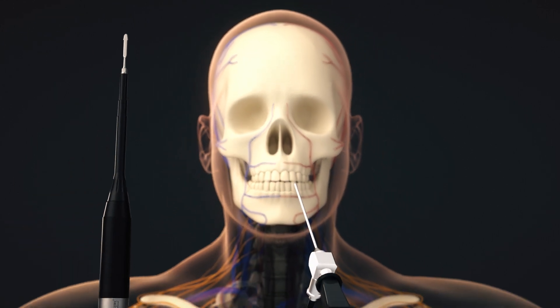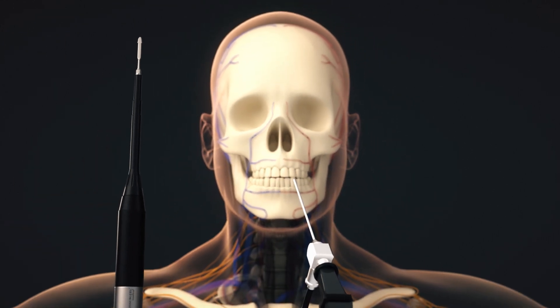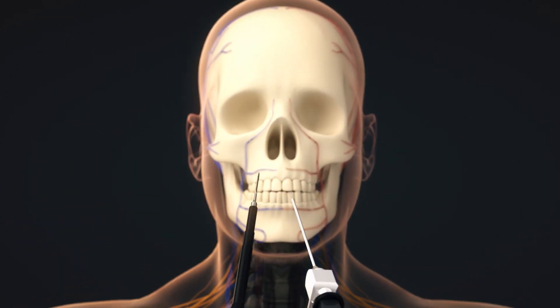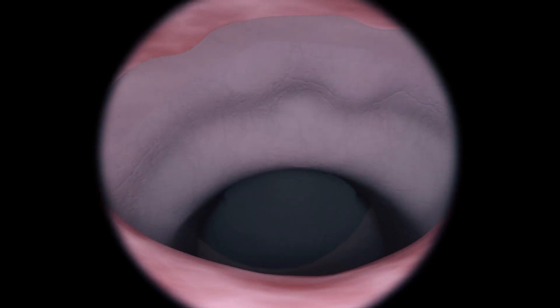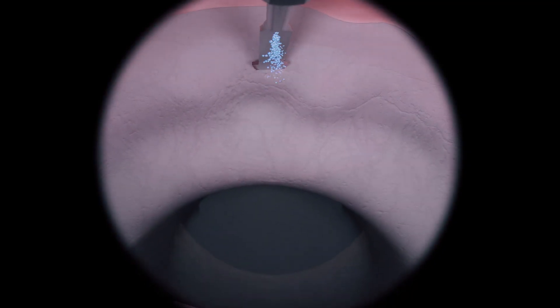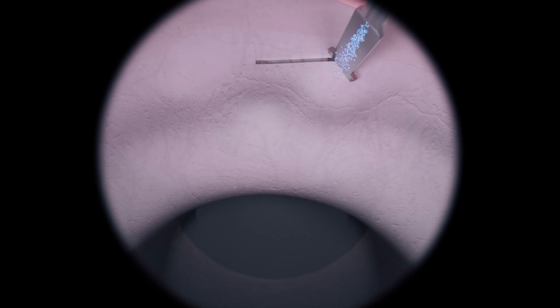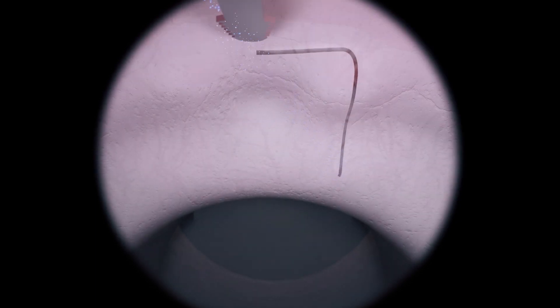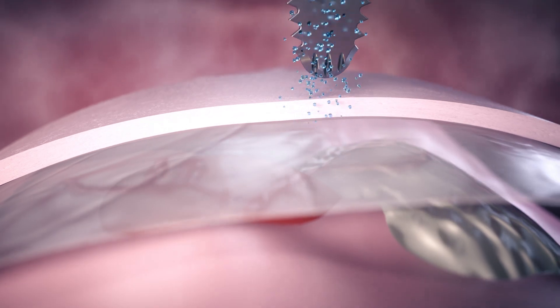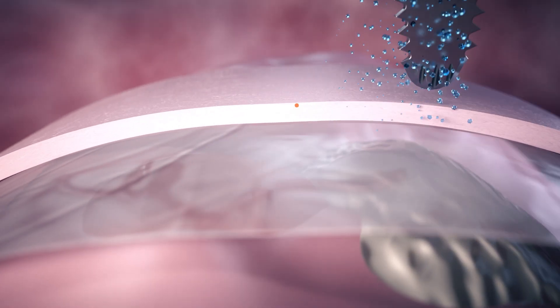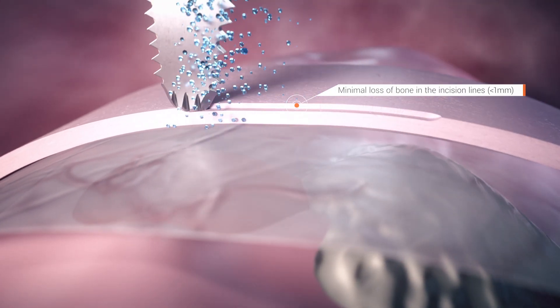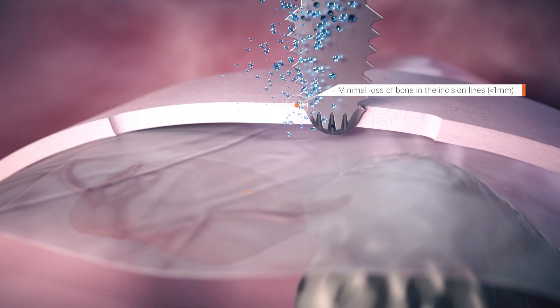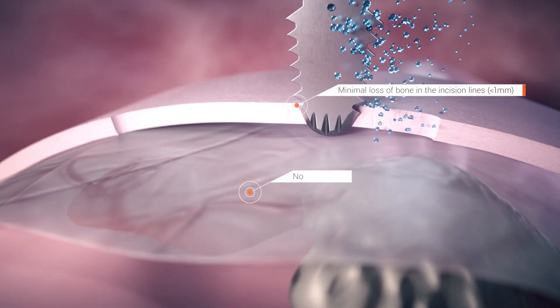The inner sphenoidal septum down to the floor of the sella is removed using cutting instruments. After free access to the sella floor has been created, the surgeon opens the anterior wall of the sella floor with piezo surgery, preserving the integrity of underlying structures.